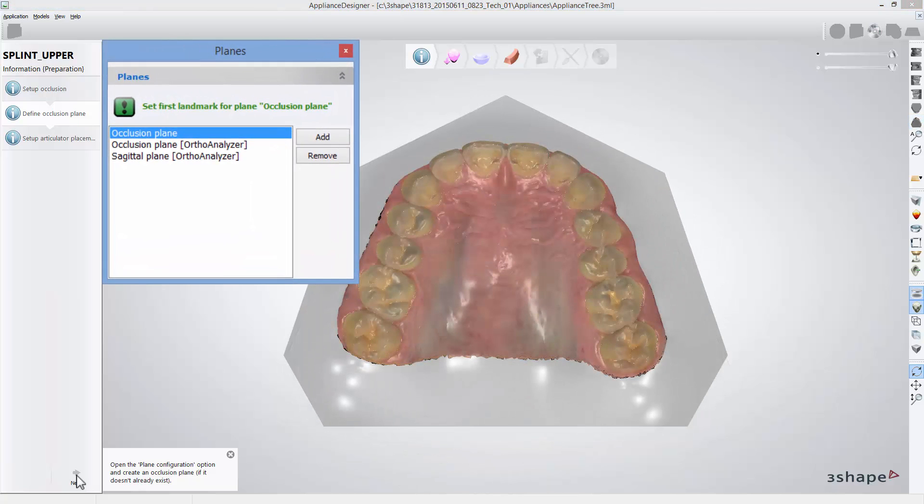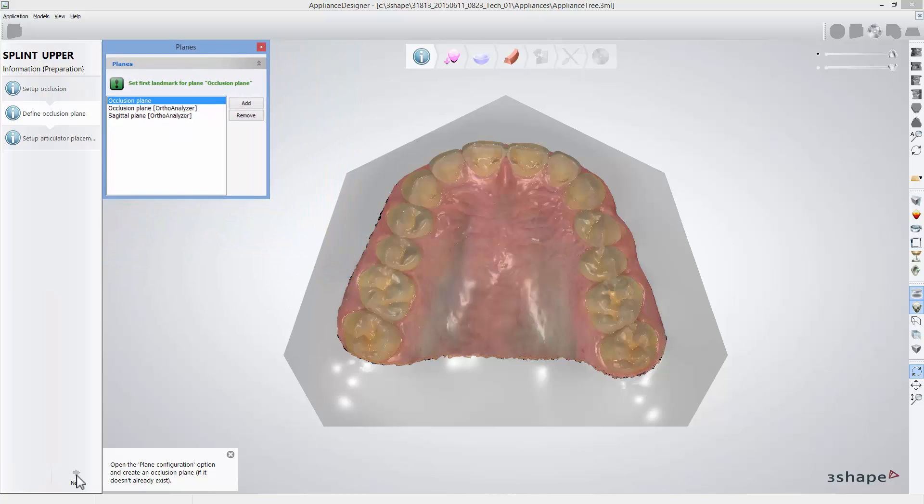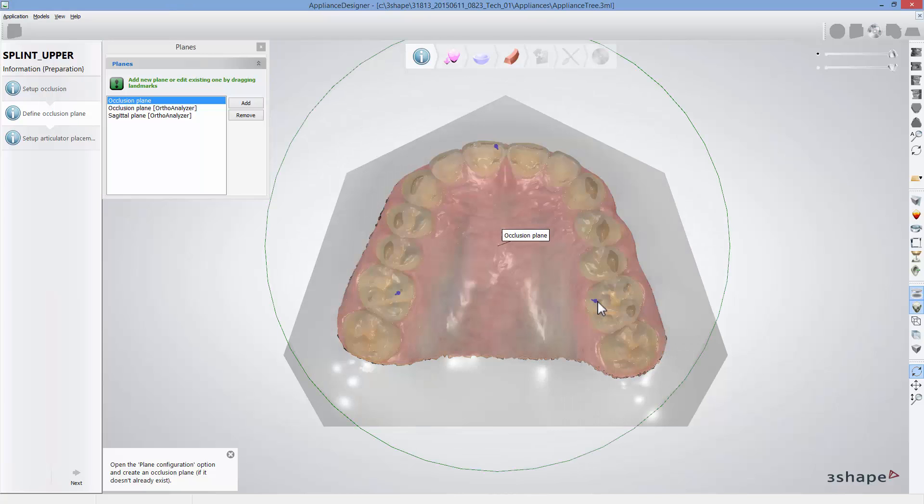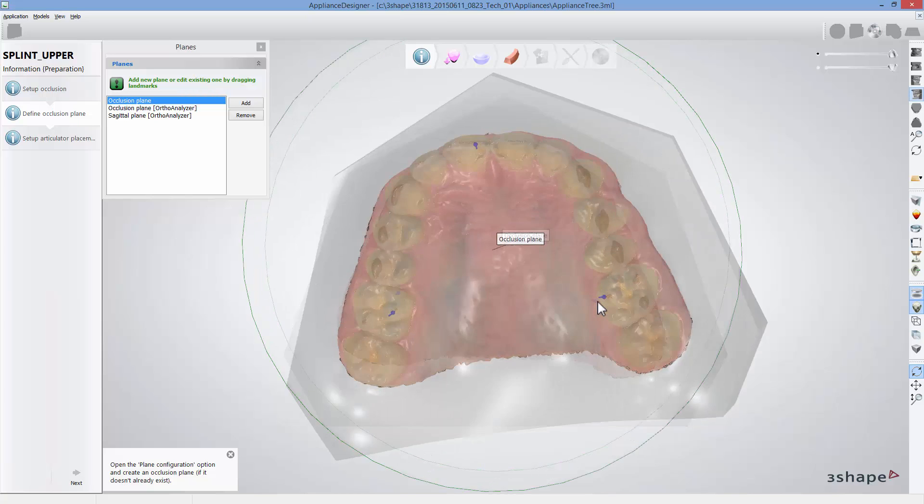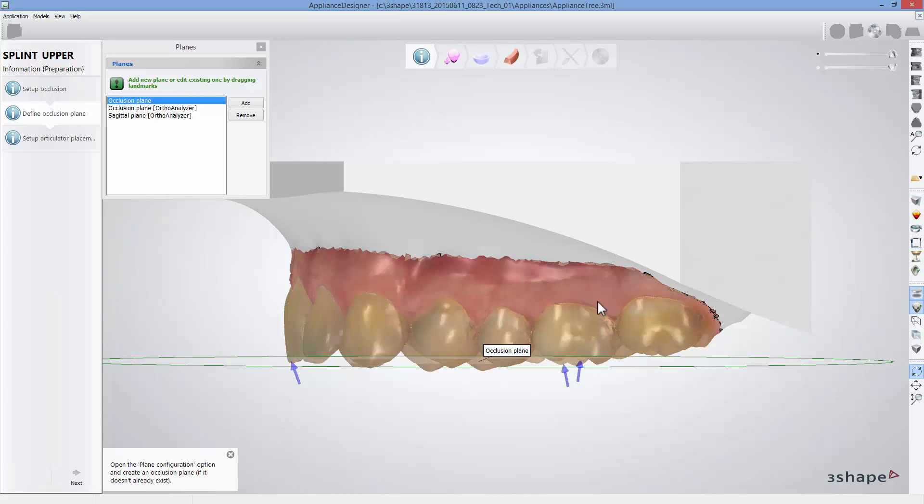At that stage you can use the plane you have already set unless you would like to change it. To do that, place three occlusal plane landmark points once again. Occlusal plane will be used to define the initial insertion line of the splint and will determine the angulation of the bar.